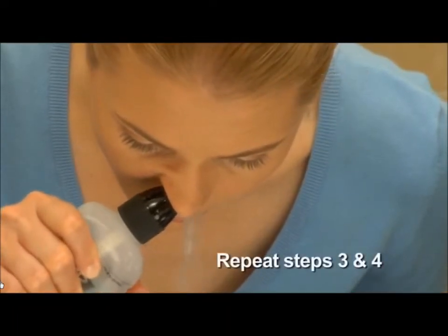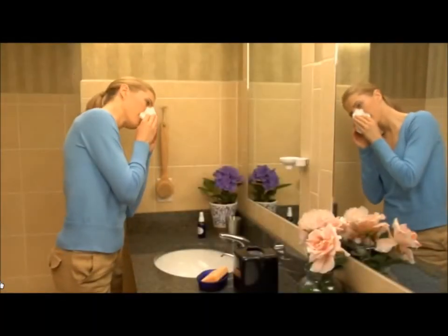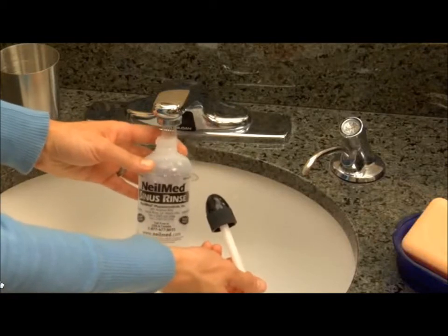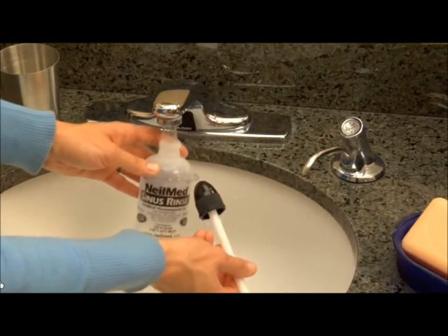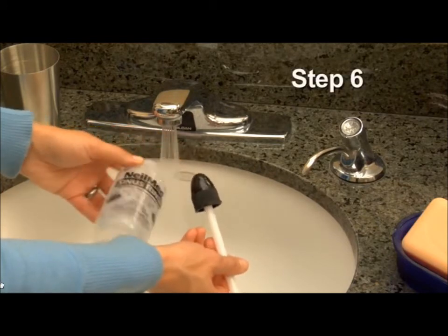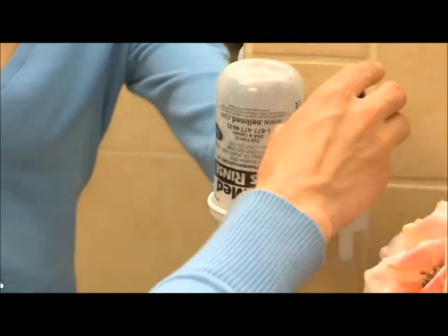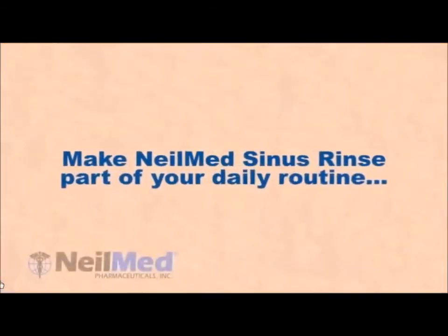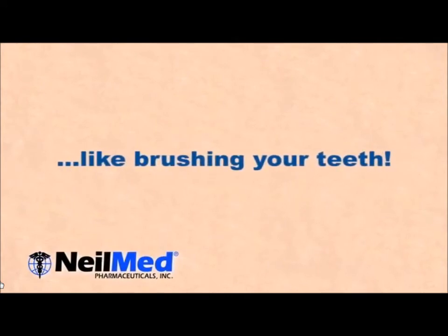Now repeat the steps for your other nasal passage. Make sure to get out all residual solution. If there is any solution left over, please throw it away — remember there are no preservatives in the solution. Air dry the sinus rinse bottle and cap on a clean paper towel or the NeilMed NasaDock, which is also used for storage. Make a fresh solution each time you rinse. It's best to rinse once or twice a day, or as directed by your physician.